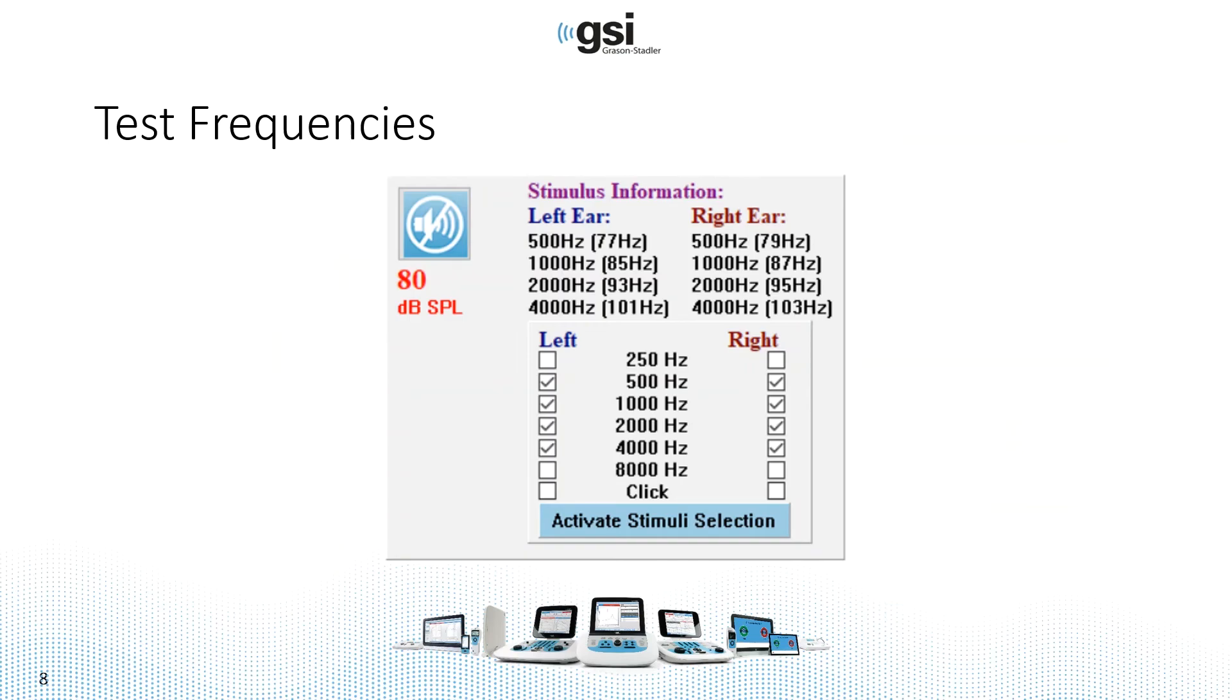To determine the test frequencies that you're going to present to the patient, you simply check the boxes for the right and the left ear. By default, 500 Hz, 1 kHz, 2 kHz, and 4 kHz for both ears are selected.